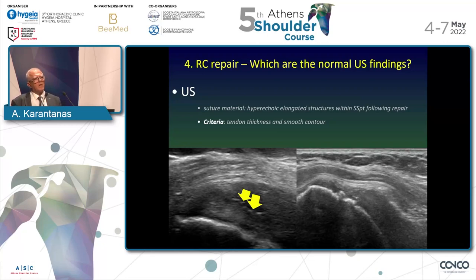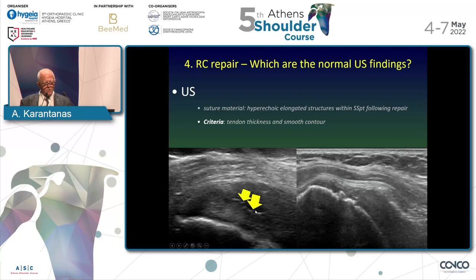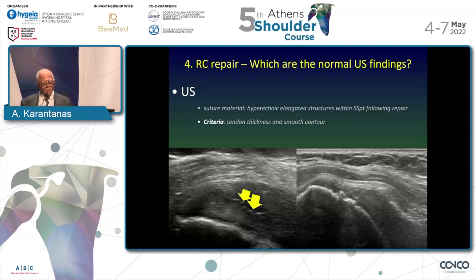Ultrasound has a more and more evolving role in assessing the post-operative patient. The normal findings consist of these hyperechoic elongated structures — these are suture material — and we may see a normal thickness of the tendon together with smooth contour.